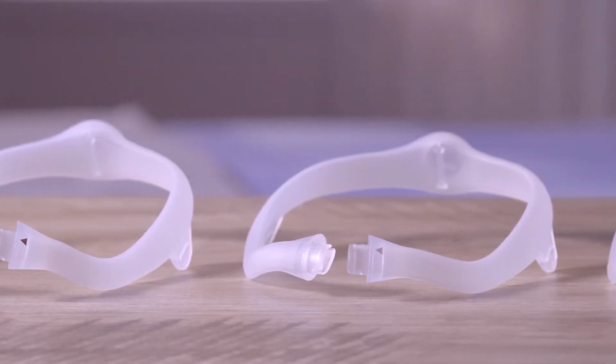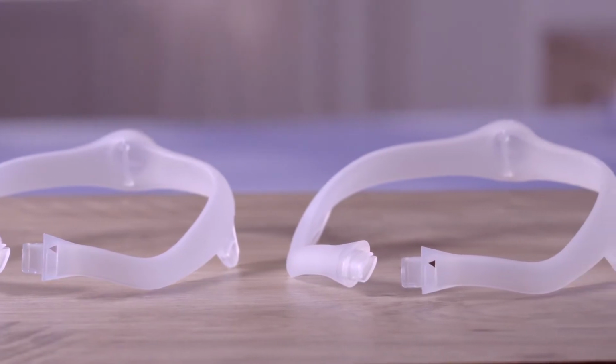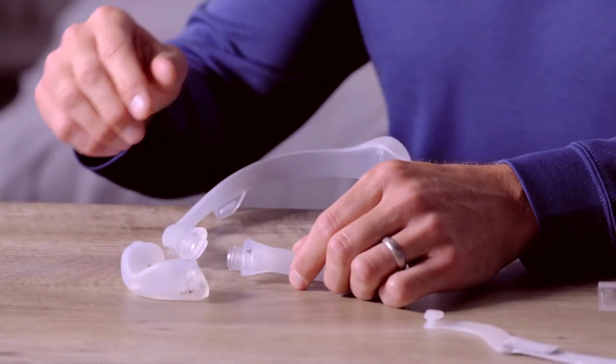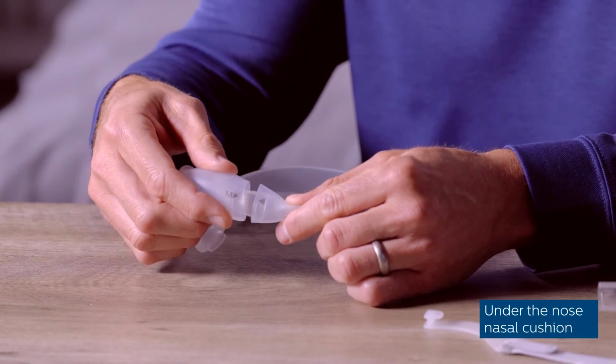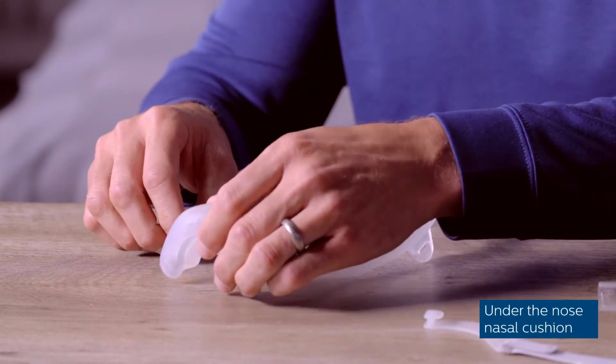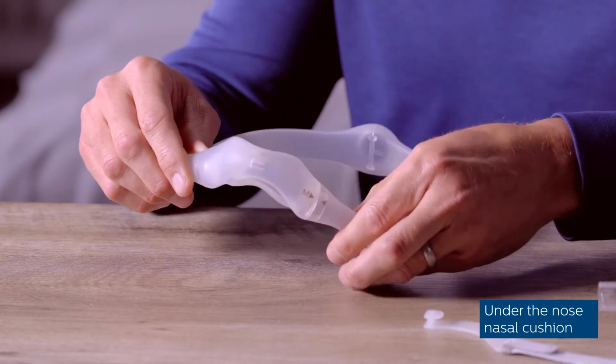DreamWear frames come in 3 sizes: small, medium, and large. If your mask is not already assembled, begin by attaching your cushion to a medium frame. Align the triangles on the under-the-nose nasal cushion to the ones on the mask frame, and press until you hear it click into place.